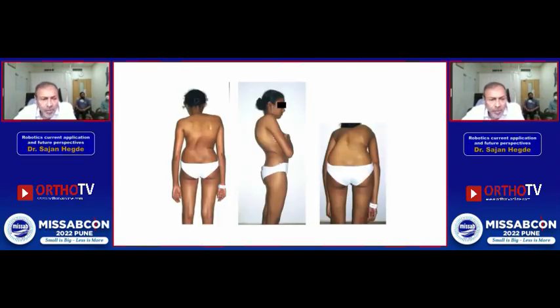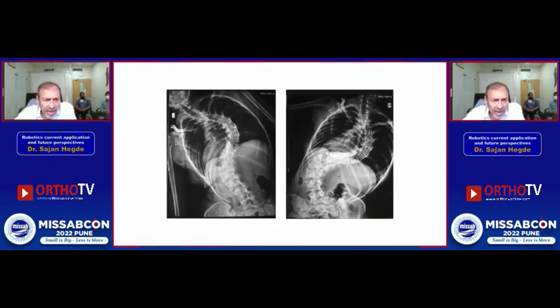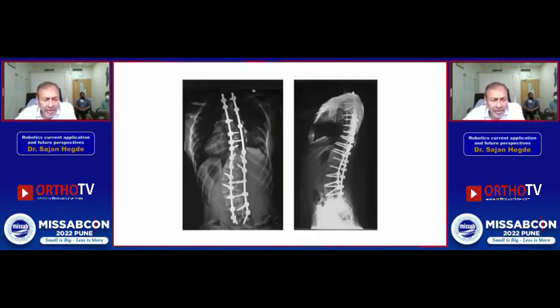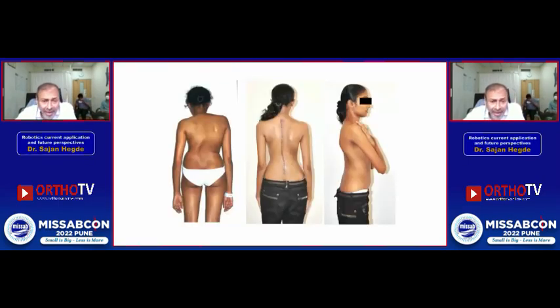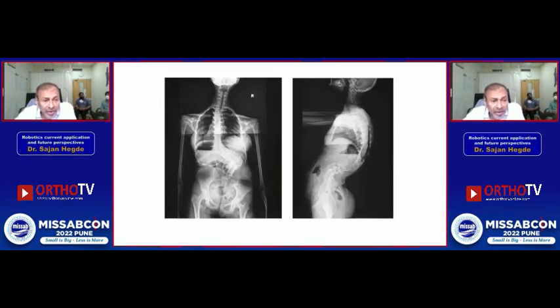So when a patient with a severe deformity like this comes, and you know that these are sometimes challenging cases to do freehand, and you assess them, and then when you are able to guide all these screws robotically, it reduces the stress levels like nothing. And here you have the same lady on the left side before surgery and after surgery. She is doing well. Now you have this child coming with a far more severe deformity.